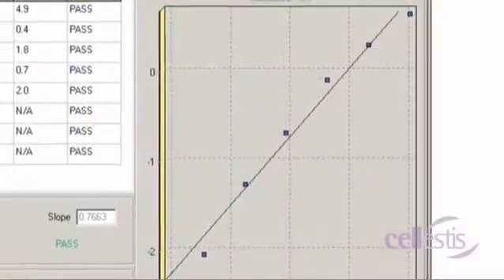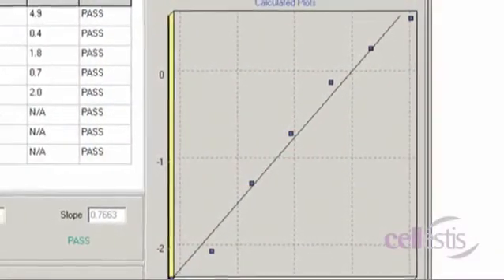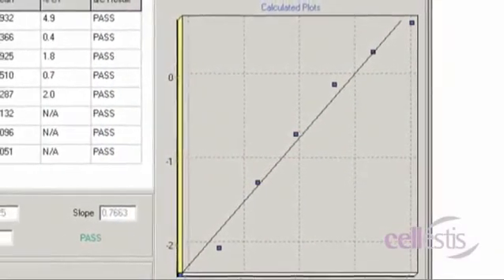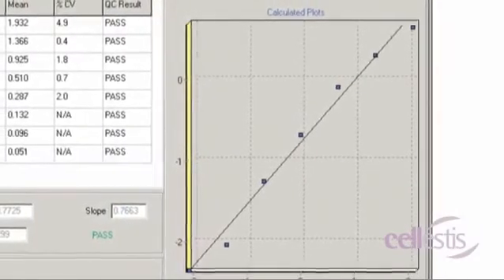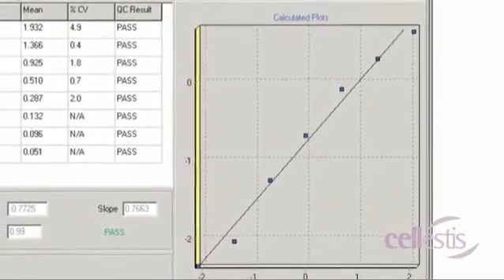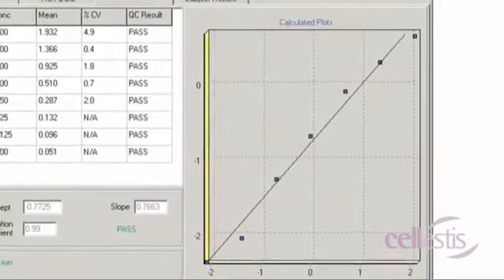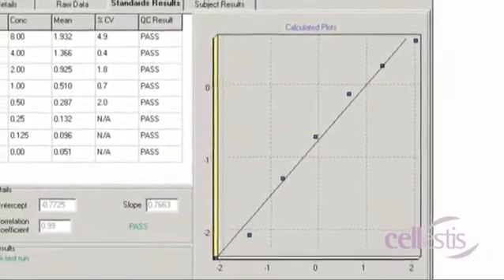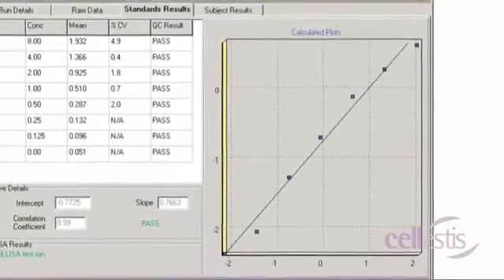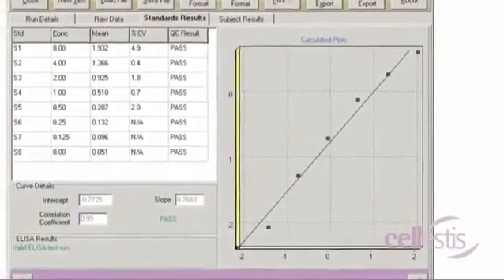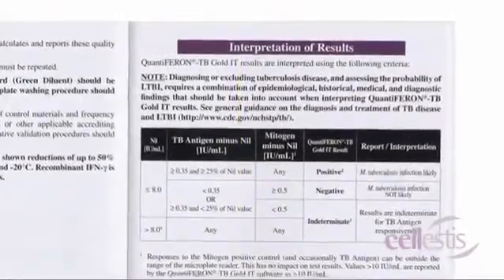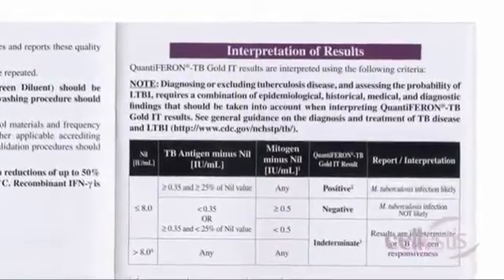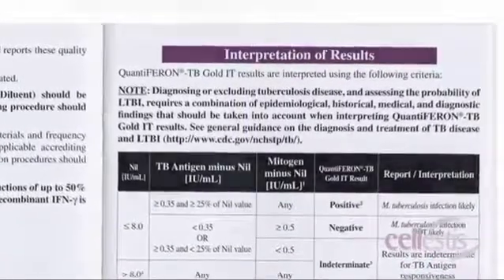The standard curve for the assay will be automatically analyzed and the Standards Results tab screen will be displayed. The software performs a quality control assessment of the assay, generates a standard curve and provides a test result for each subject as detailed in the Interpretation of Results section of the Package Insert.